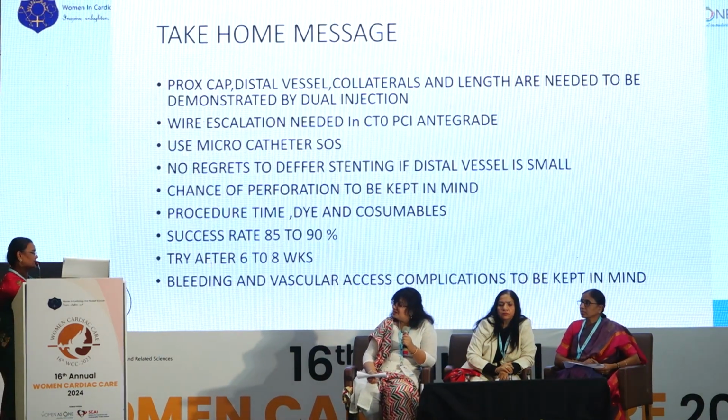What was the procedural time in such a case? The senior operator tried first, and after that I went in. I succeeded, and totally it took around 1 hour. As there is a flush total occlusion, the missing segment was more than 20 millimeters and there were no significant collaterals, is it advisable to perform a CTO in such a case, or just hand over?